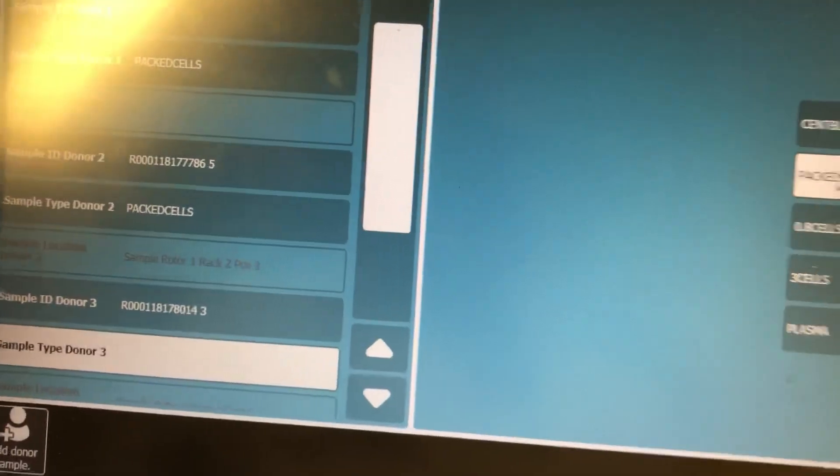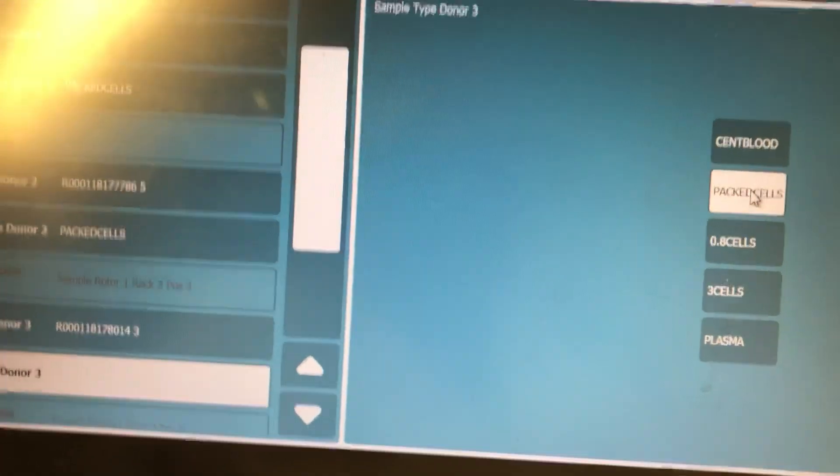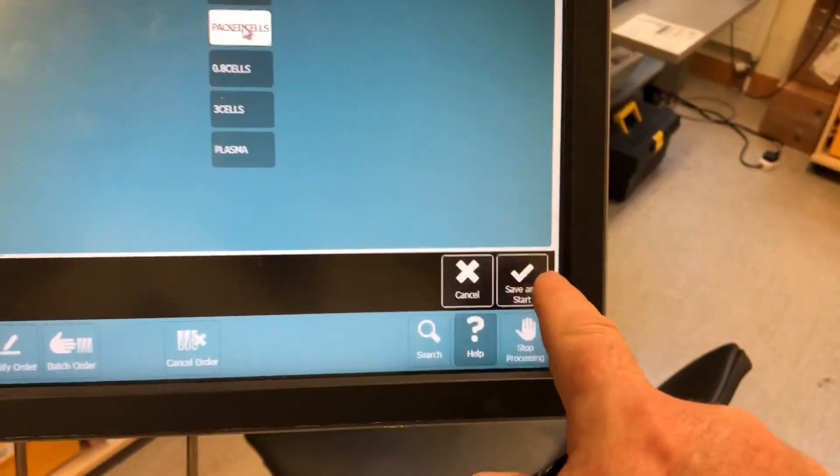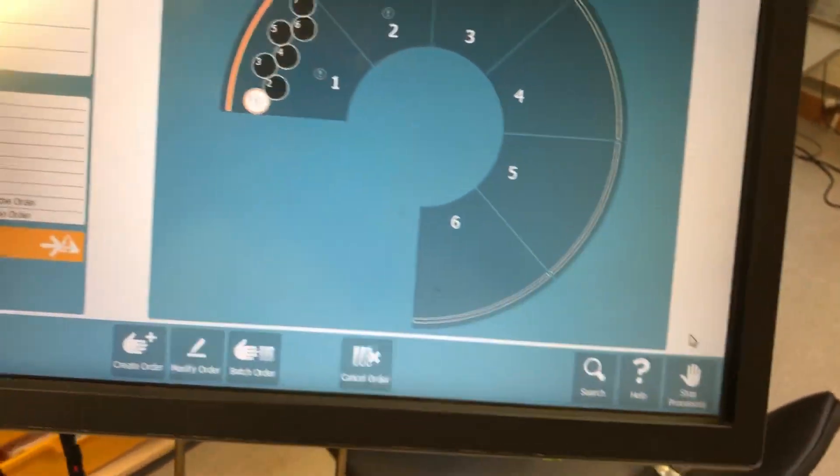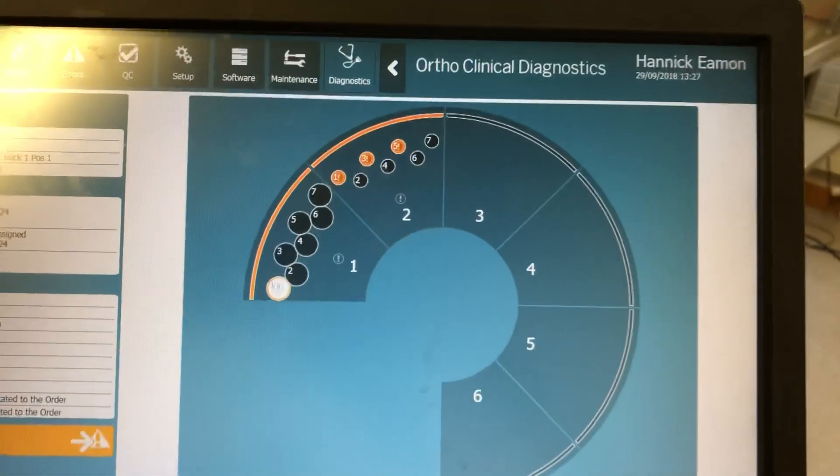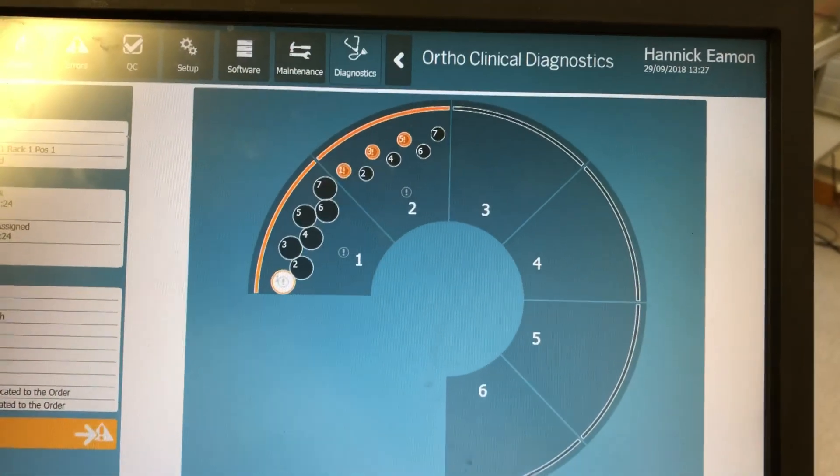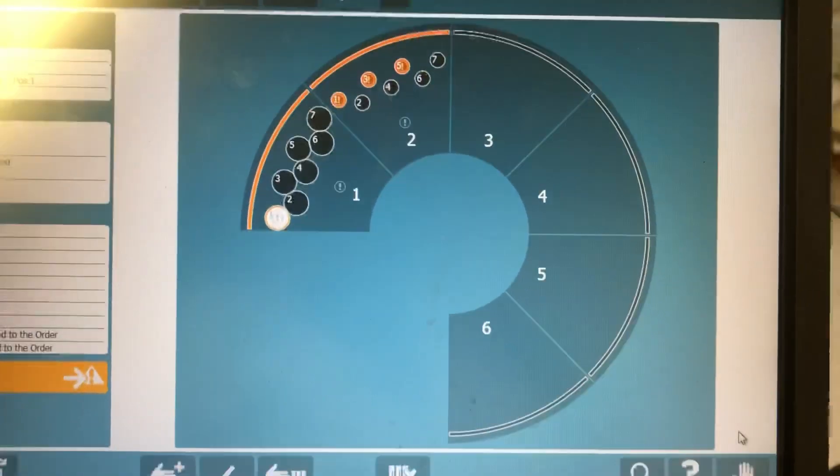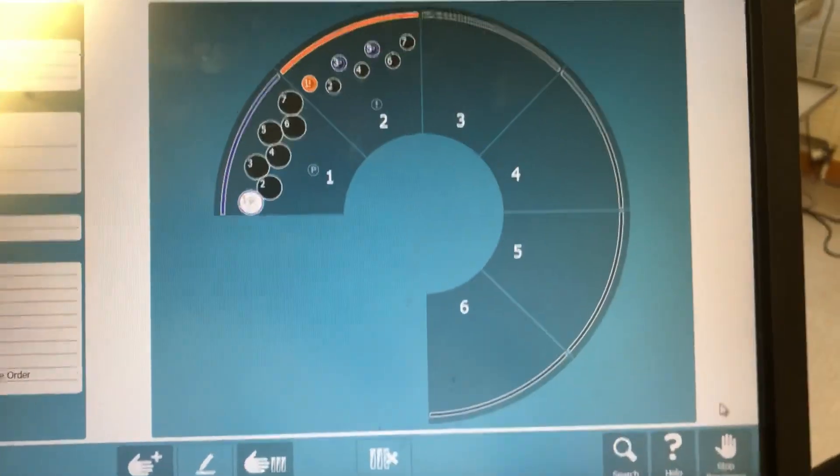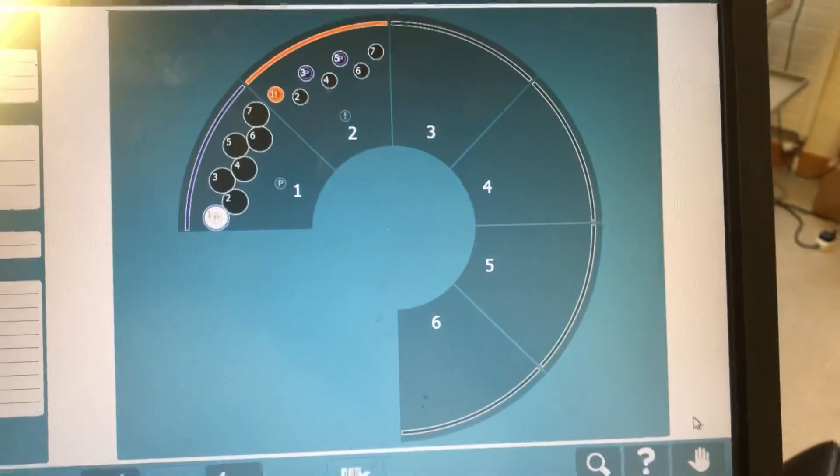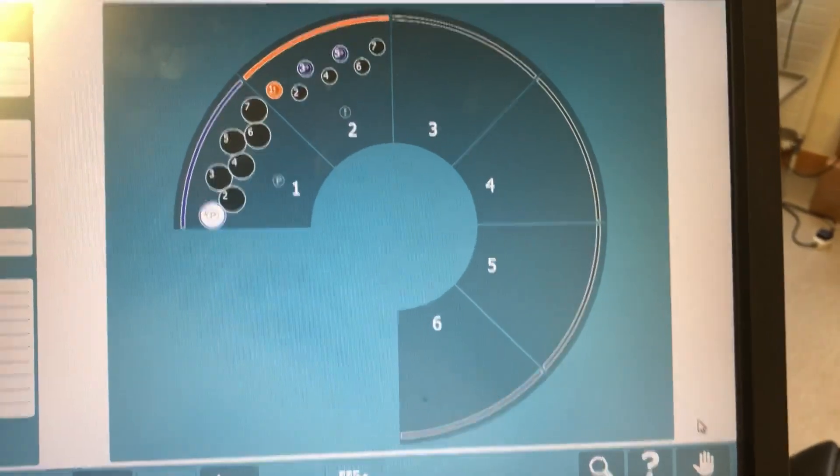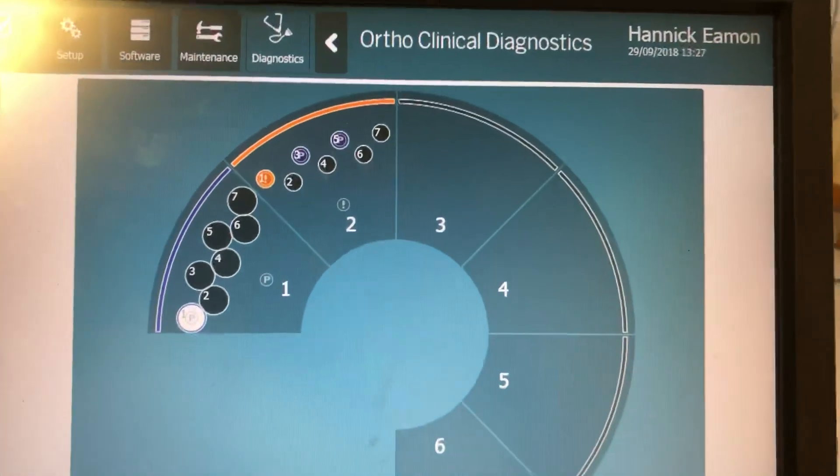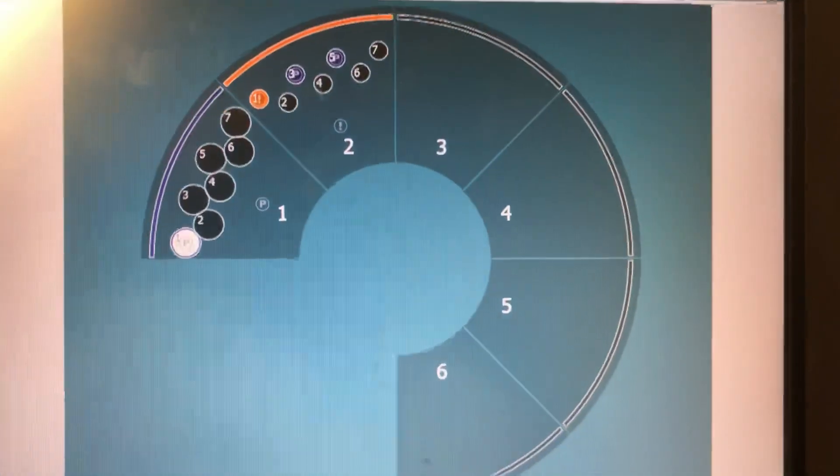When I'm happy with all my order I click on save and start. And the screen should update. And there we see it, screen is updated. It's after picking up the tests.